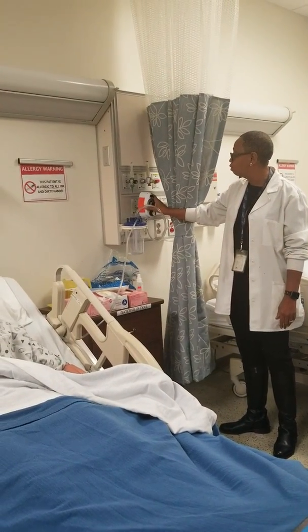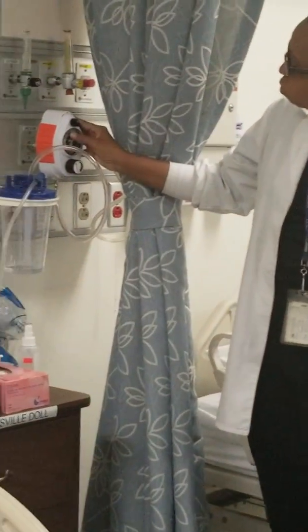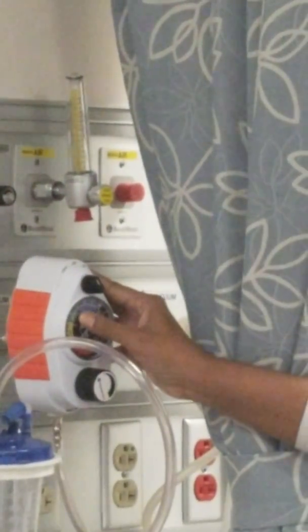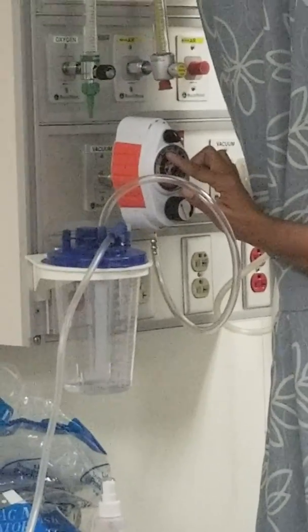And this will move up into the area is what? Low, medium, high. What does my suction need to be on? 125? 120? This ain't a guessing game. Look at your sheet. Between 100 and 120. Absolutely. And where did you get that information from? Oh, you got it off the paper. So I have to dial this until it rests between 100 and 120.